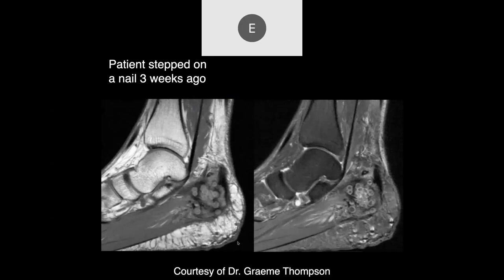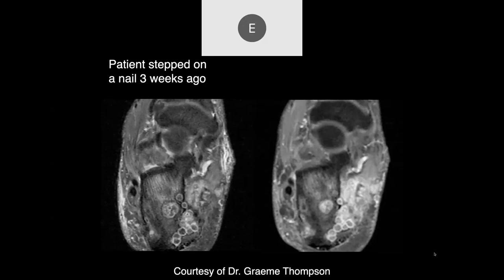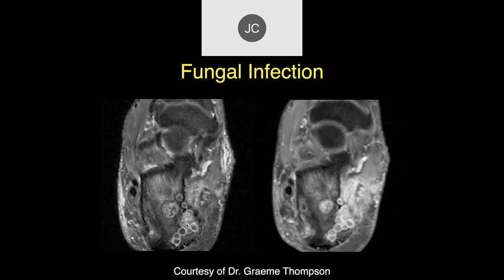A patient who stepped on a nail three weeks ago. In the medial posterior soft tissues, there's a very unusual circular signal — little bullseye-like patterns all through the tissue. This was all due to infection. This is a fairly characteristic appearance of fungal infections — I've never seen this in a regular bacterial infection. It probably also happens with actinomycosis and some atypical bacterial diseases, but it's pretty characteristic of fungal infections.